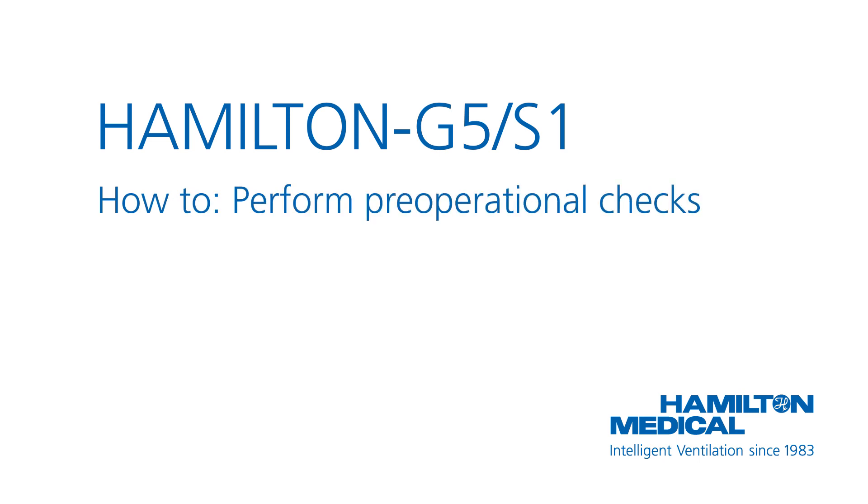This how-to video will show you how to perform the pre-operational checks, including calibration of the flow sensor and a breathing circuit tightness test. You will also learn how to perform calibration of the oxygen sensor and zero calibration of the CO2 sensor.